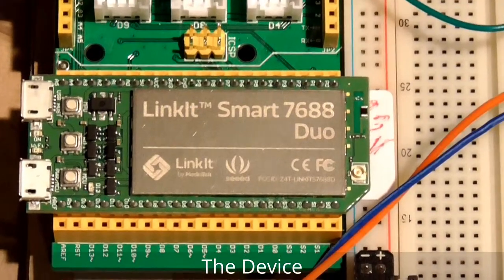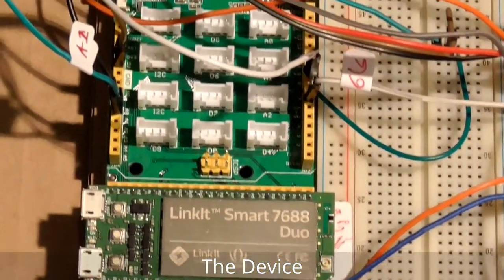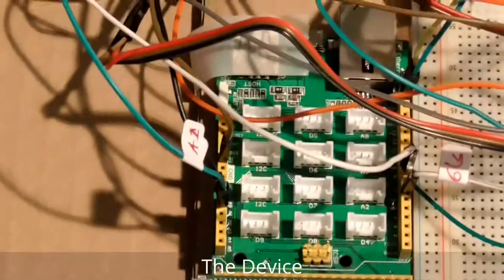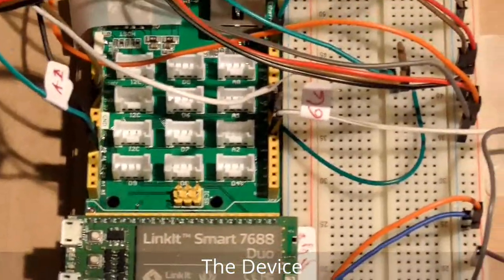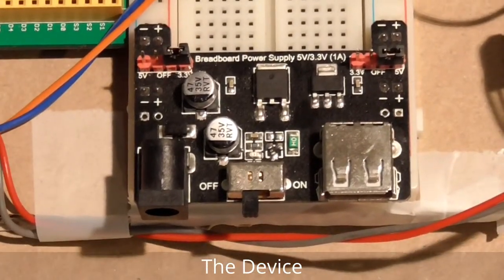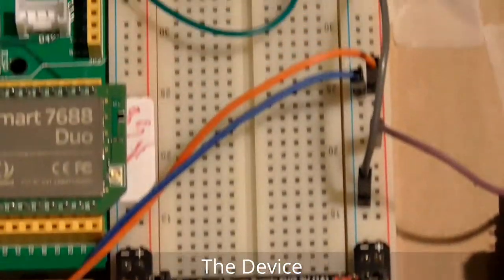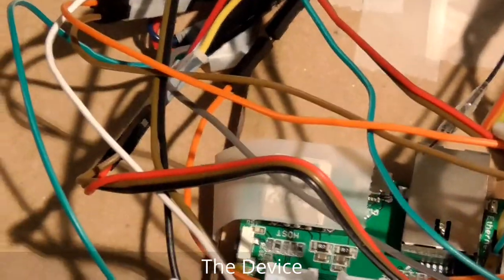The brain of the device is the LinkIt Smart controller, which is the main controller of this device. I have also used an Arduino shield for connecting other sensors. This is the power board power module, and there are a lot of cables.